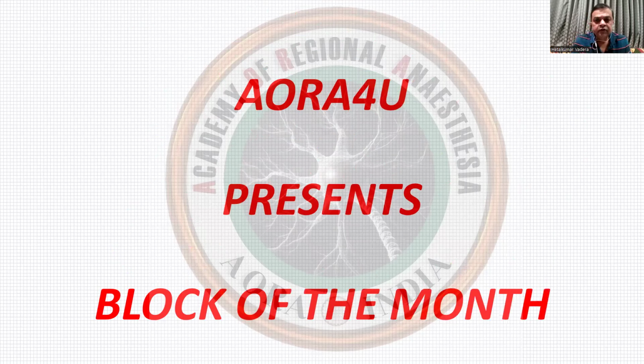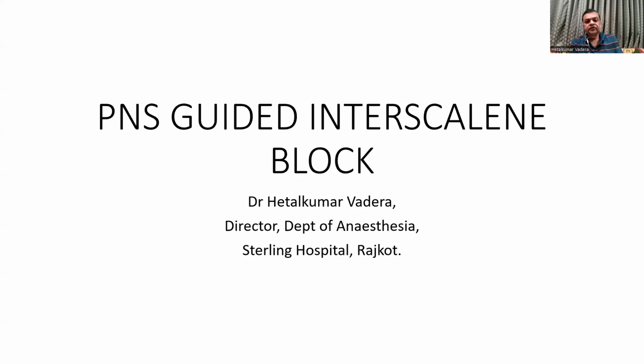I'm really very excited to share with you that we are starting a new series, that is Block of the Month. We will share one block every month on our AORA Facebook page and various social media platforms. And we will describe the single block technique and we will try to answer all your questions. So the first block is PNS guided interscalene block.